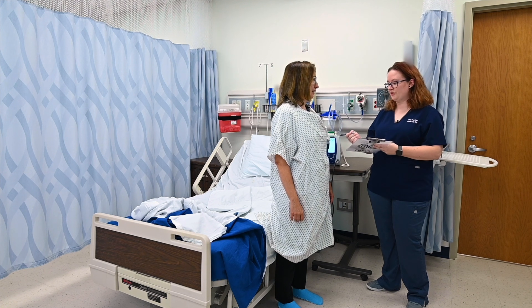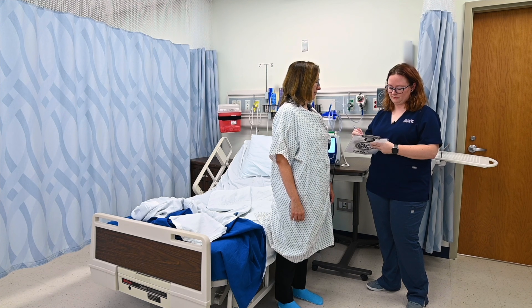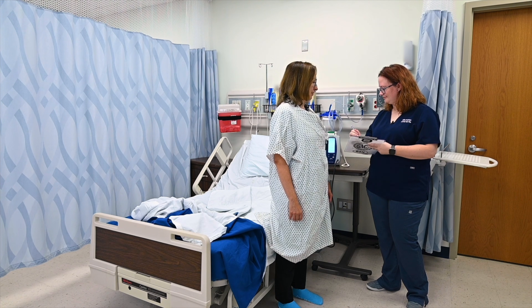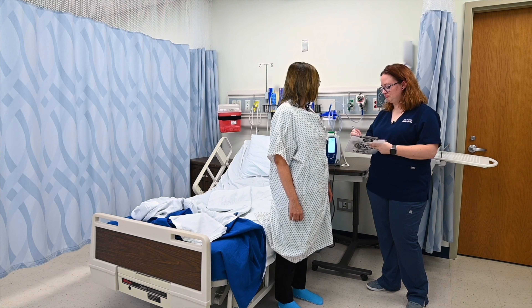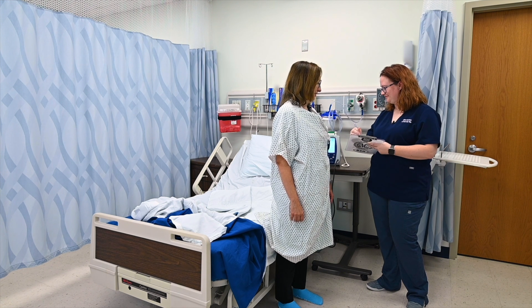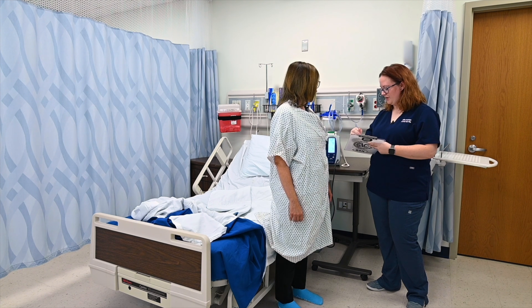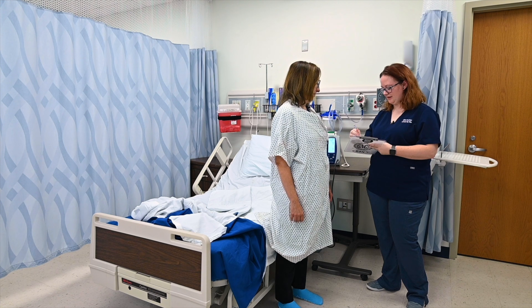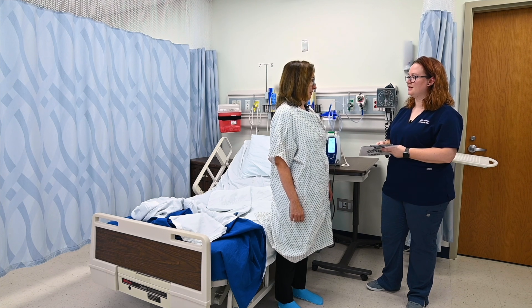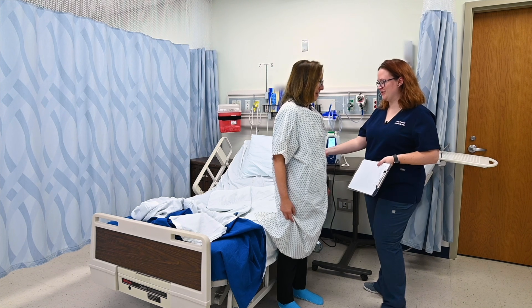So what we're looking for is if your blood pressure or pulse changes significantly. We got 127 over 78 and your pulse is 56. I'll go ahead and tell your practitioner those results and they'll be back in touch with you about it. Now I get my apple juice! I'll get your apple juice — go ahead and sit down for me.